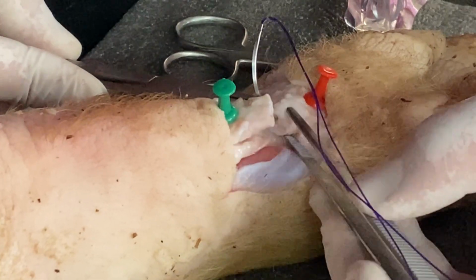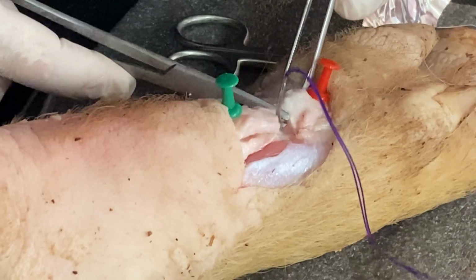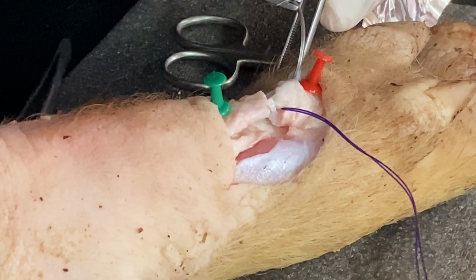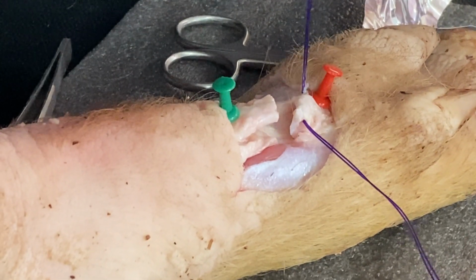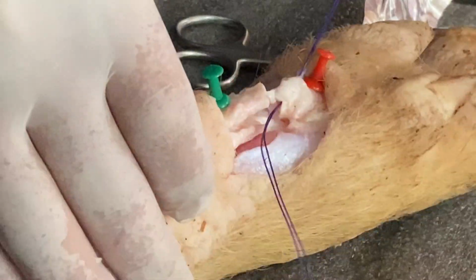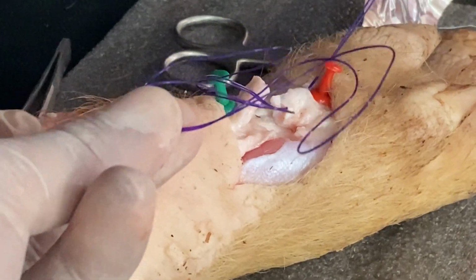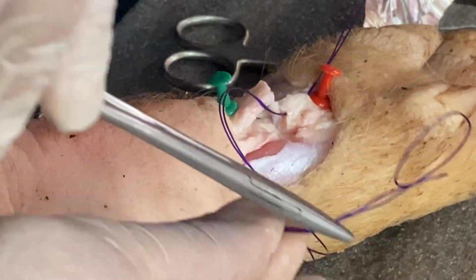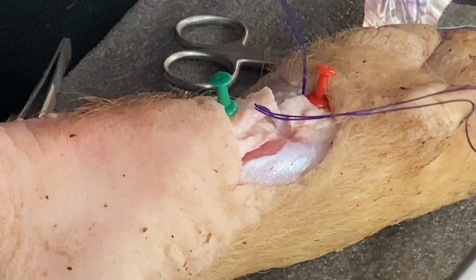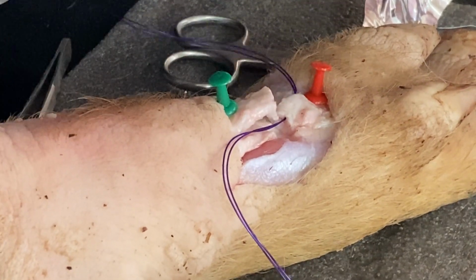Okay. Sorry? Yes, can you see? Yes. Now we will try to take it out from one side. See? It came from this side. Okay. After that, a portion of the thread or the suture is kept nearer to the wound so that we can make a thread lock. And after that, we need to orient our needle. It needs to be oriented in a transverse direction, like that.